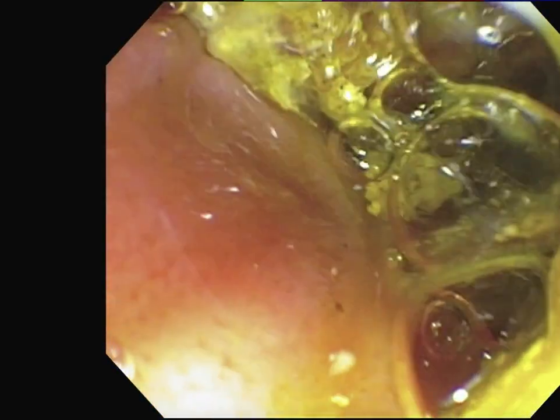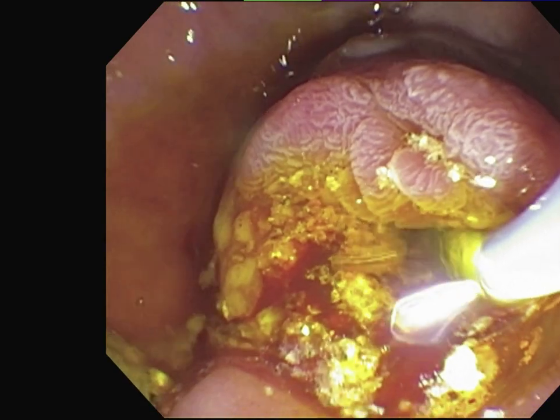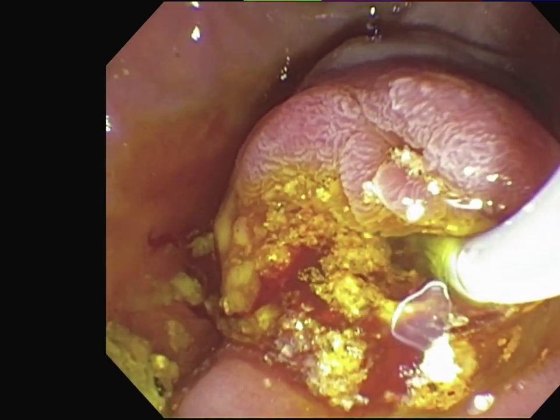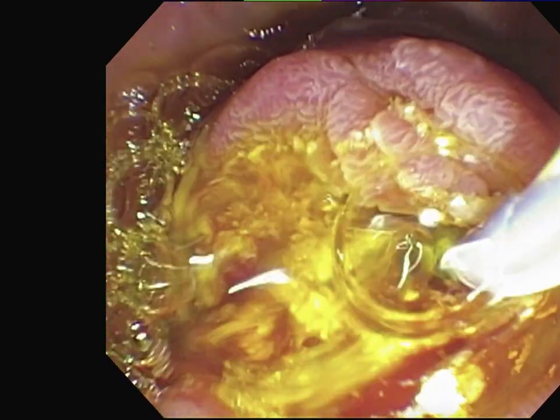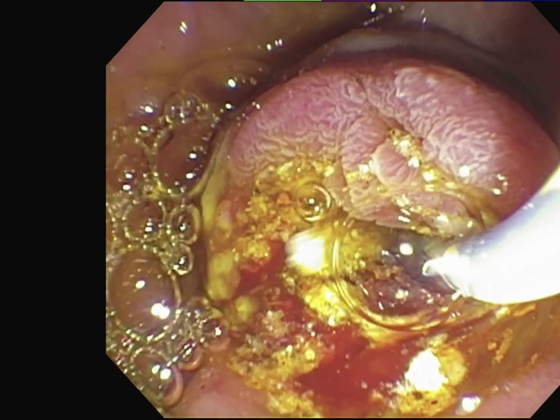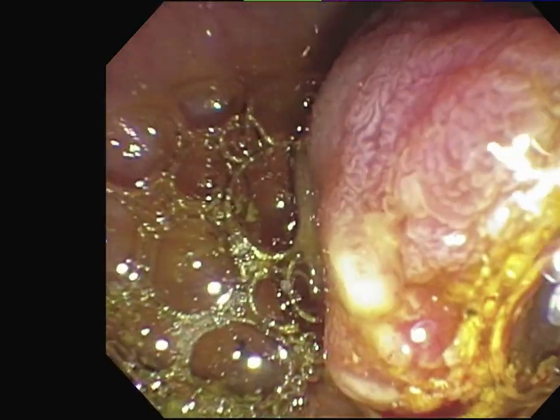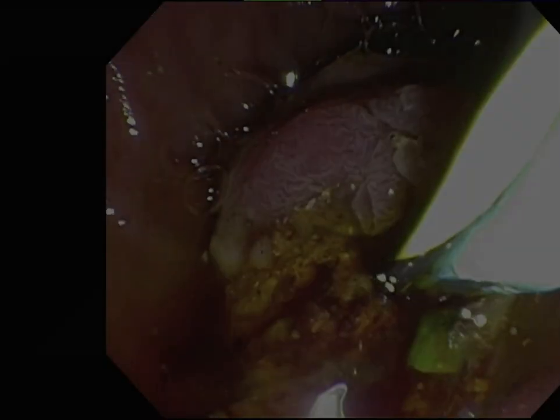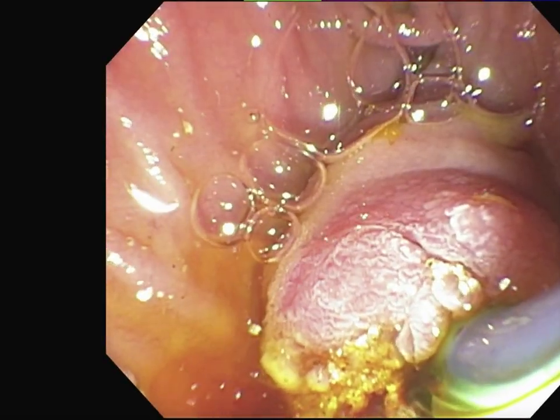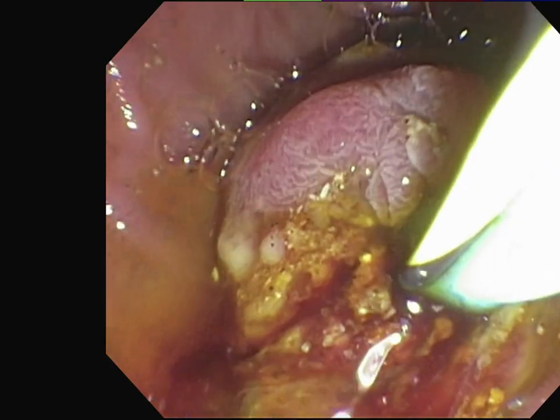The patient's biliary stent was clogged with debris and was removed. Multiple balloon sweeps were performed. There was a large amount of biliary debris that was cleared from the biliary tree, including small fragments of stones. A 10 French biliary stent was placed under standard fluoroscopic and endoscopic guidance.